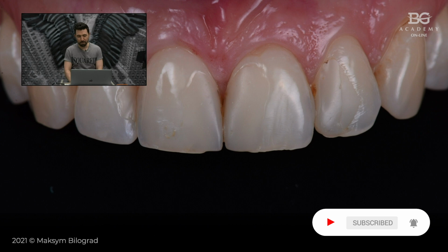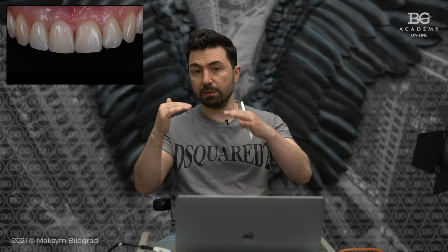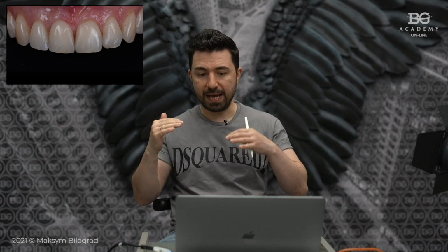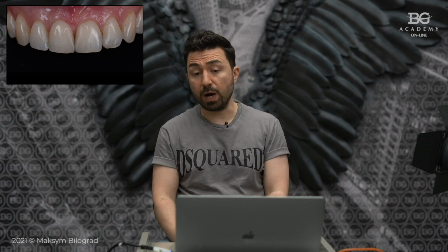Before I continue explaining step by step our approach, I would like to ask you one question. If you take a precise look at this picture, you'll be able to see the difference between levels of enamel and composite on all of these teeth. Especially it is very visible on tooth number 21 and tooth number 22. You can see enamel that is higher than the level of composite. So we have some step between two structures. And it is very important to understand why it happened.